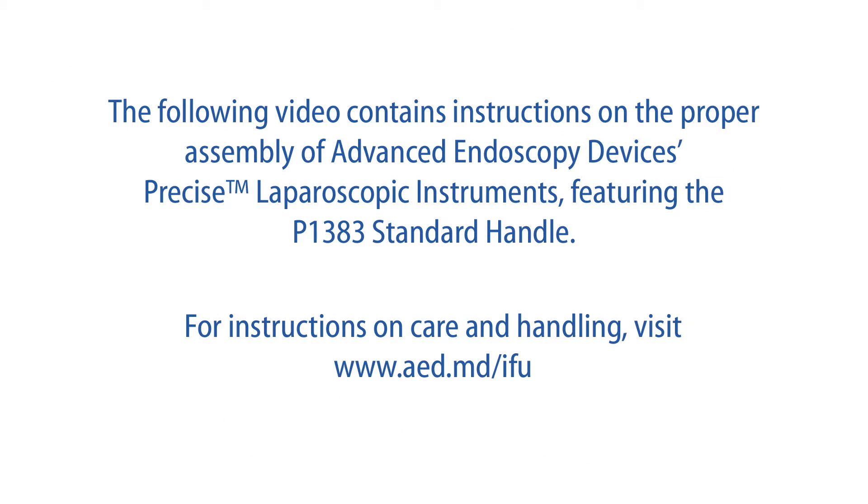The following video contains instructions on the proper assembly of AED's precise laparoscopic instruments featuring the P1383 standard handle. For instructions on care and handling, visit www.aed.md/ifu.